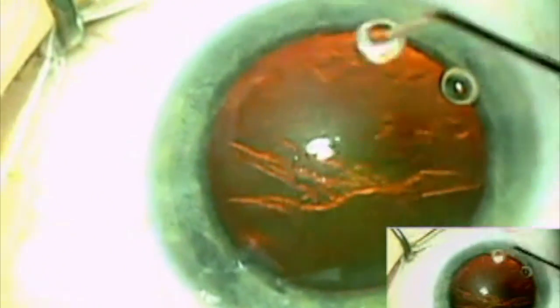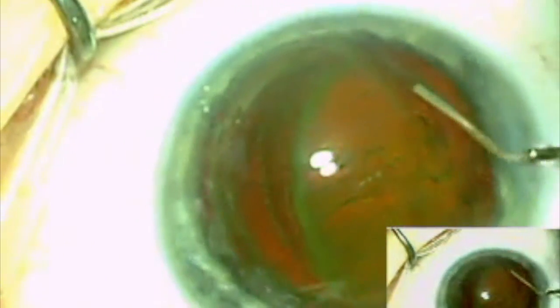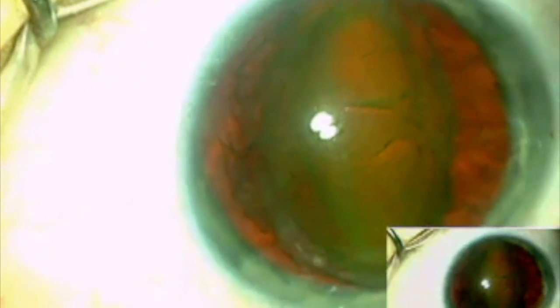Once the capsulorhexis has been accomplished, a hydrodissection cannula is placed under the anterior capsule and a fluid wave is used to prolapse the nucleus into the anterior chamber. The lens is then cracked between a cyclodialysis spatula and the phaco tip.